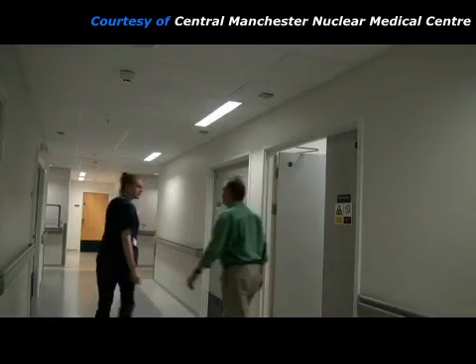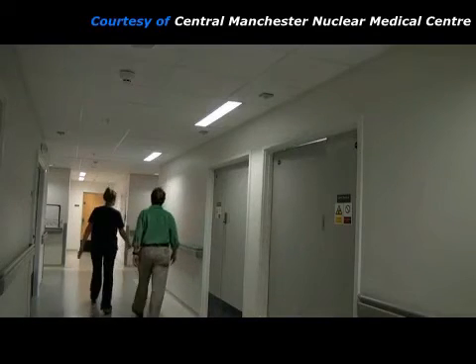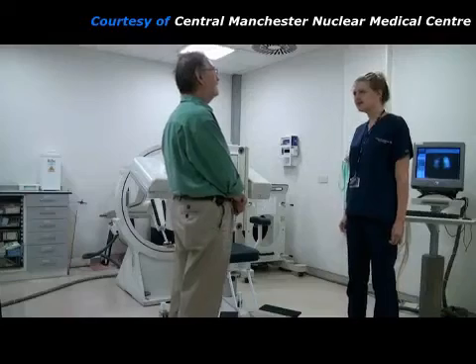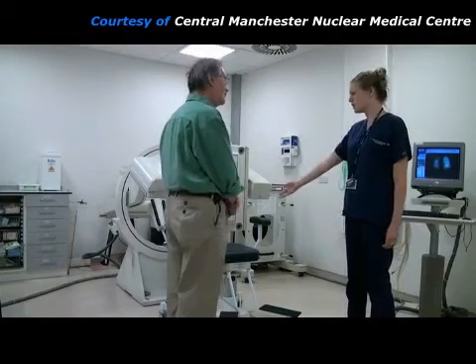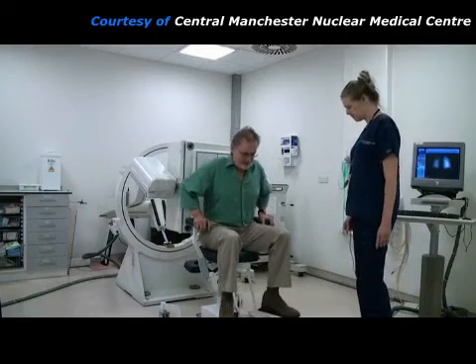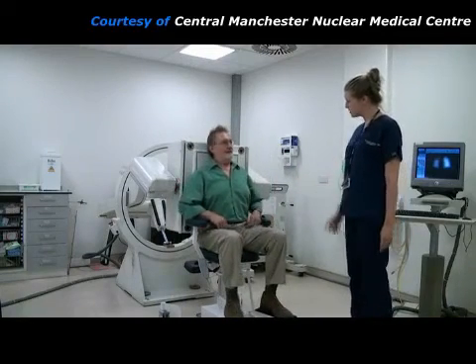After he has received his injection of radiopharmaceutical, the patient is taken to the gamma camera room where pictures of his lungs will be taken. The patient sits on a chair with his back to the gamma camera whilst it takes a picture that shows the blood flow to his lungs. This is known as the posterior perfusion picture.